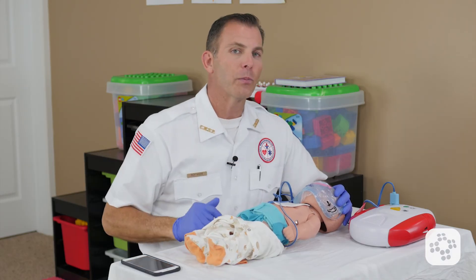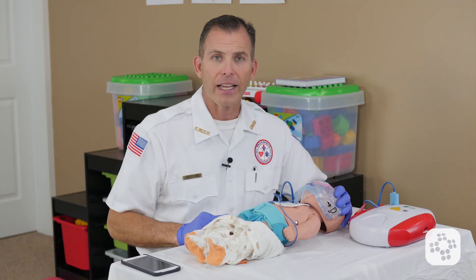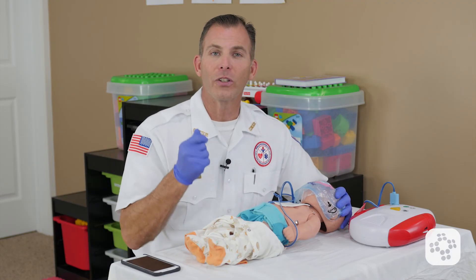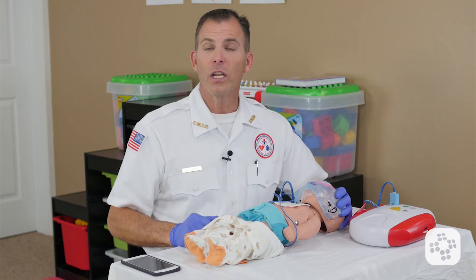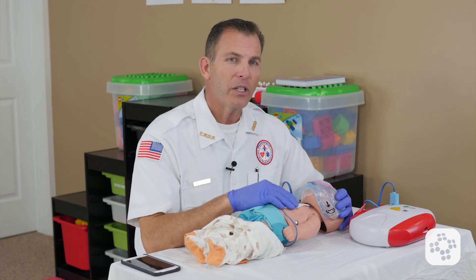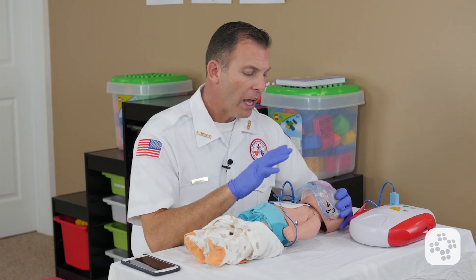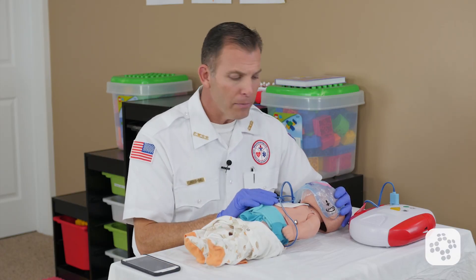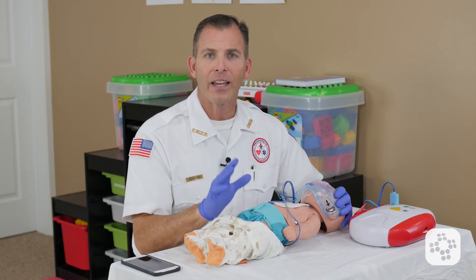You will be interrupted potentially from time to time by the AED. Simply follow the prompts and continue your protocol until EMS arrives, someone equally trained or higher comes to relieve you, or the baby actually regains consciousness. If the baby does regain consciousness and starts to breathe on their own, though we may stop doing CPR at that time, we would leave the AED intact and allow it to monitor the patient until EMS arrives and takes over.